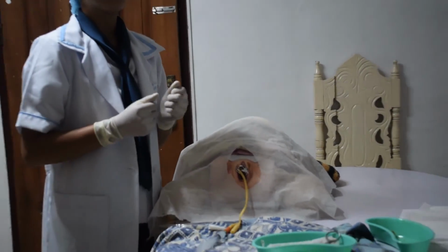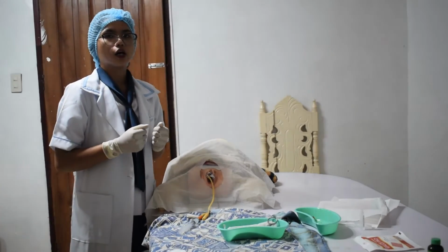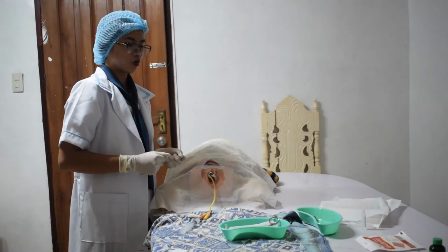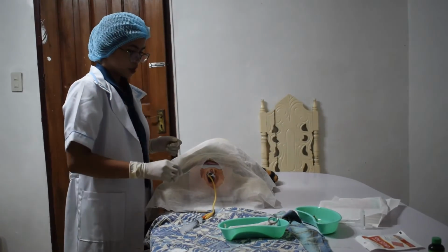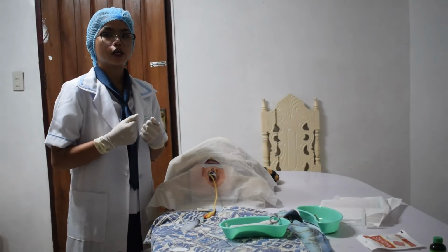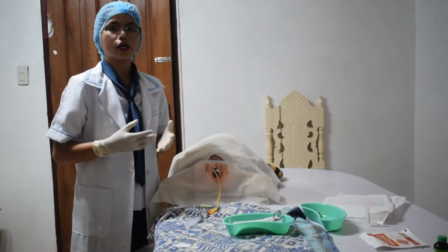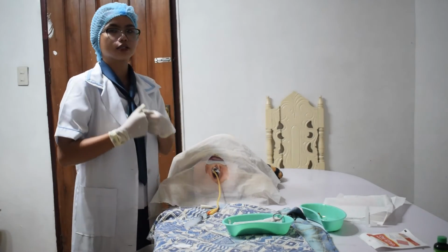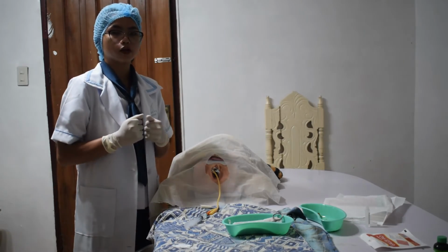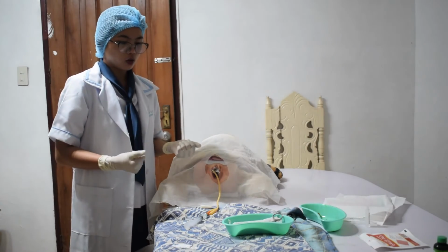For males, some agency policies advise advancing the catheter to the bifurcation of the catheter. If the catheter is accidentally contaminated, a new sterile catheter must be used. Collect a urine specimen as needed. Allow 20 to 30 ml to flow into the specimen container. Close the lid.